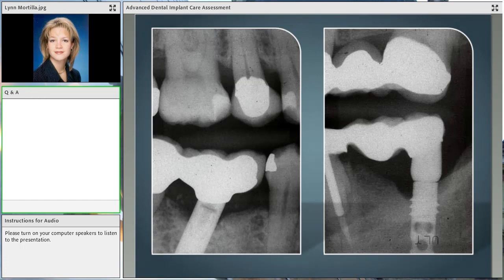2 different mouths here on the left and right side. On the left side, we see that 2 crowns have been connected, which we do not do anymore in implant dentistry. We know that the difference between the ankylosis of the implant and the periodontal ligament of the tooth can cause some serious problems. We can also see some other things going on in the maxilla. We can see that the angulation of this implant is kind of off skew. It's not parallel to the biting surface. That implant isn't placed parallel there to absorb the load. So we see those problems.